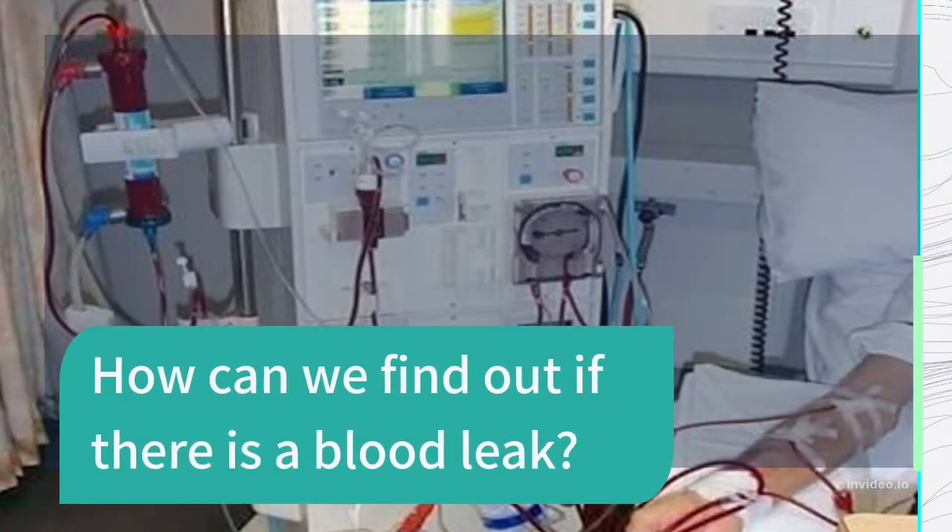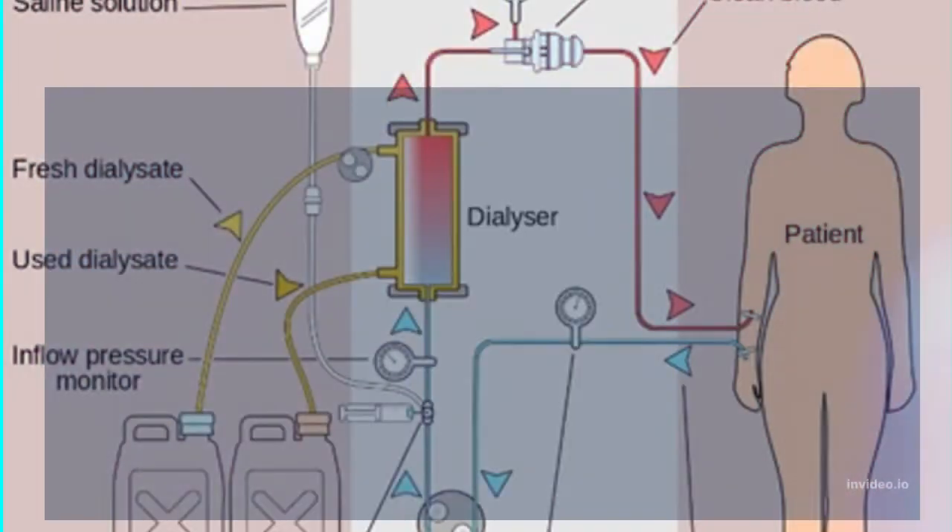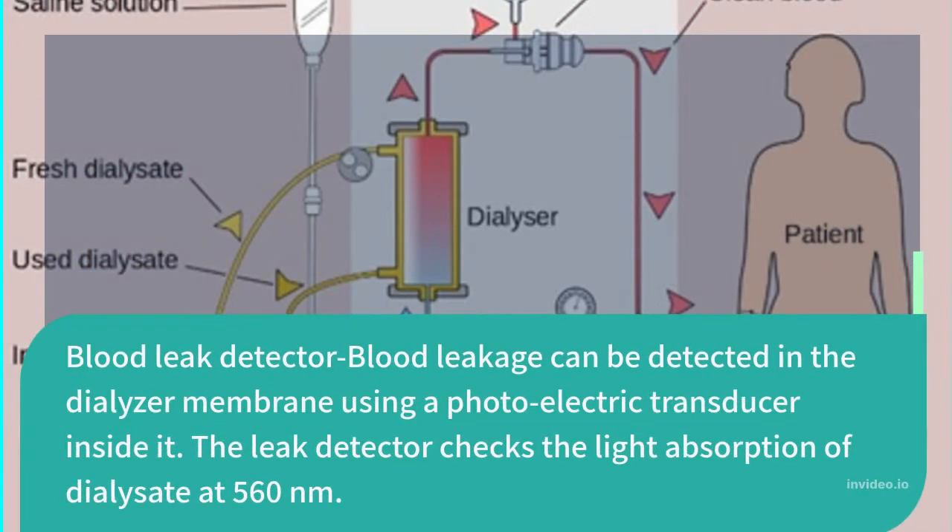How can we find out if there is a blood leak? Blood leakage can be detected in the dialyser membrane using a photoelectric transducer. The leak detector checks the light absorption of the dialysate at 560 nm.